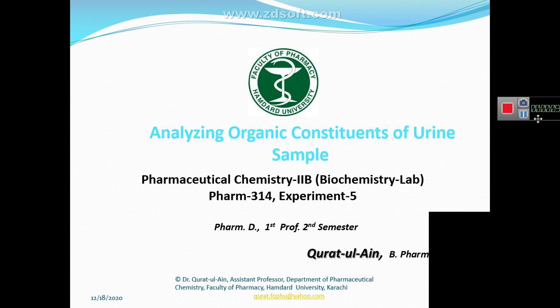Today we are discussing experiment number 5, and in this experiment we are going to discuss how we can analyze the organic constituents that are present in a urine sample. This experiment is part of our course, Pharmaceutical Chemistry 2B, Biochemistry Lab, course code 314, and this is my experiment number 5.